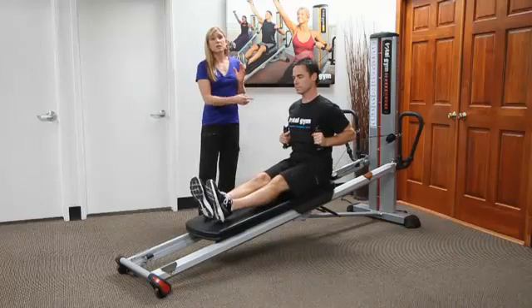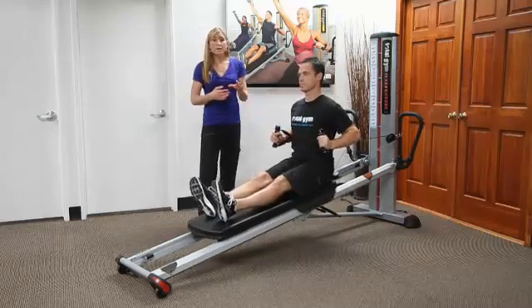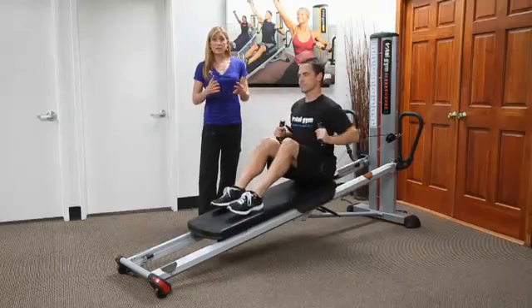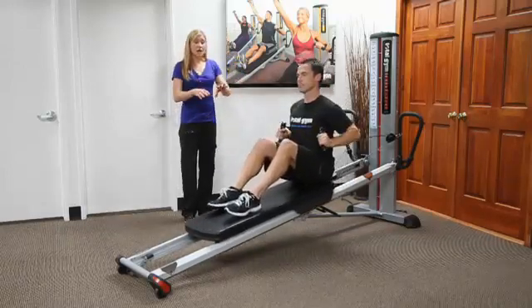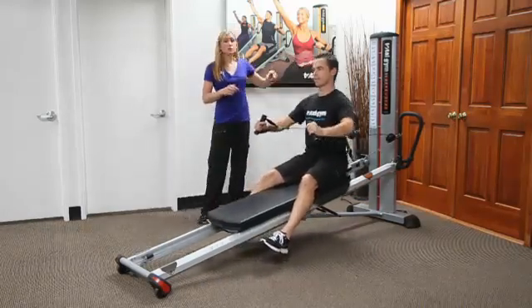In this position, if he's long sitting, that requires a lot of hamstring flexibility. So now we're kind of moving into the mobility section. If he's having problems there, sometimes bending the knees might help. I often find that people might grip with their hip flexors, and this actually changes more the stabilization requirements. So oftentimes when I'm working with my patients, I'll have them straddle and just have their feet up off the ground. One of the nice things is we're going to transition to back rowing.